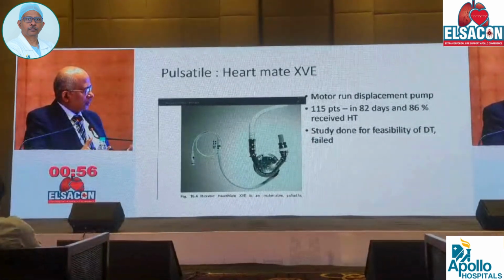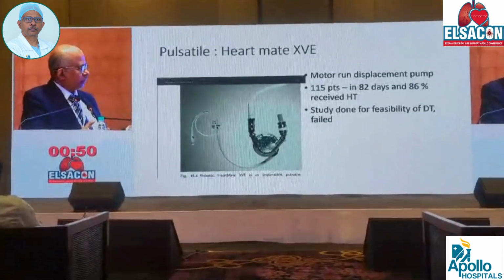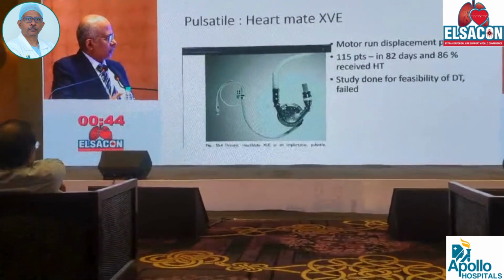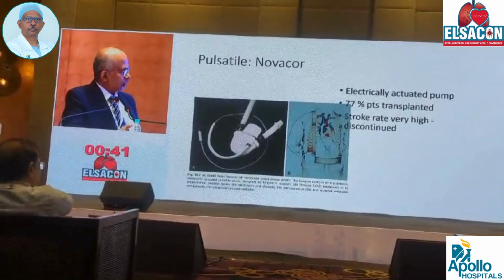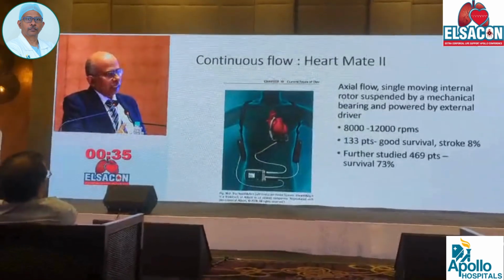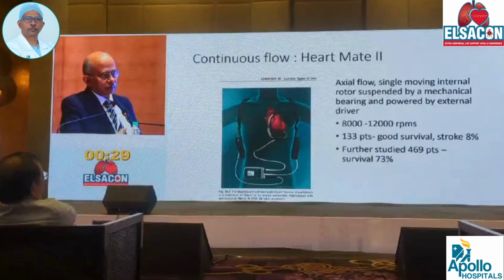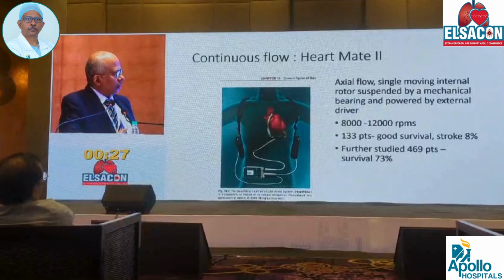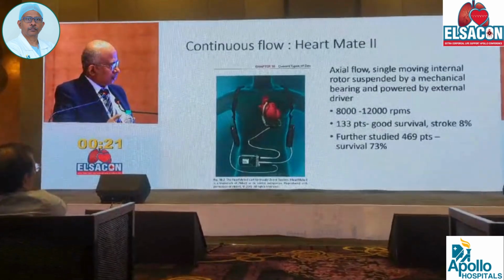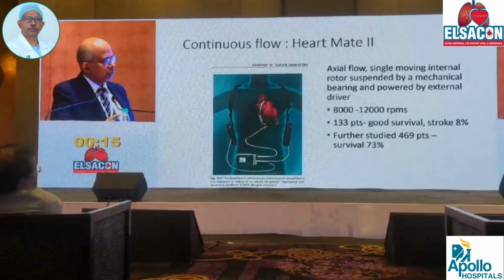In India, it was first done in the All India Institute. When I was training, we had the chance to work with these devices, but they were discontinued, and slowly devices like the Novacor started developing. Then one of the best clinically used was an axial flow device, which we call HeartMate II. This had a good run for quite some time, but there were a lot of issues because of the pump getting stuck, because of thrombosis of the pump, and there had to be a lot of reoperations, and also there was a high incidence of stroke.